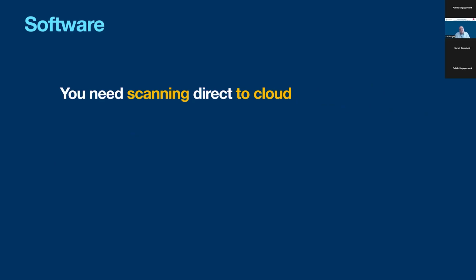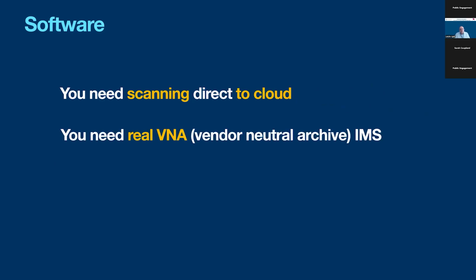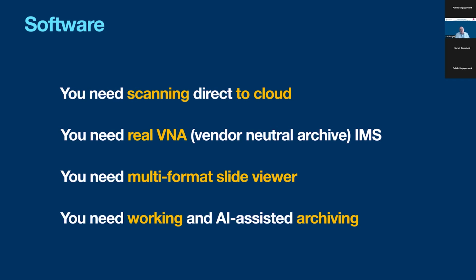Software, you need to scan to cloud. You have to have a real VNA. That's important when you are selecting your vendor. You have to have a vendor who is able to release your images when the marriage is broken. You need a multi-format slide viewer in order to view different types of slides in their native format. And also you need to have an archiving strategy. Hopefully it is AI assisted.